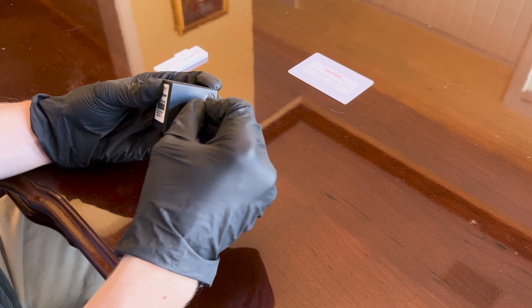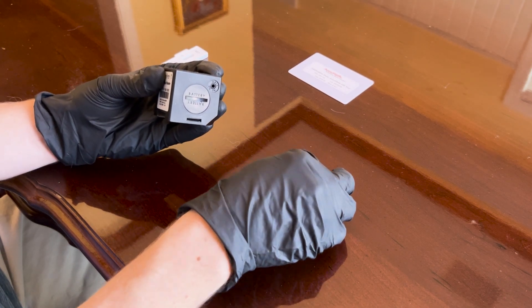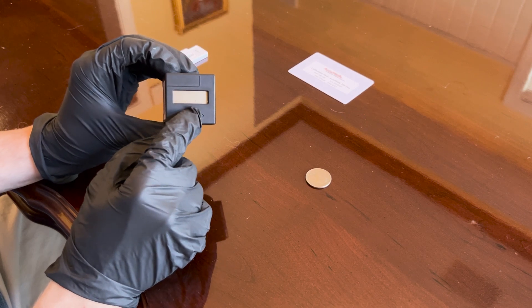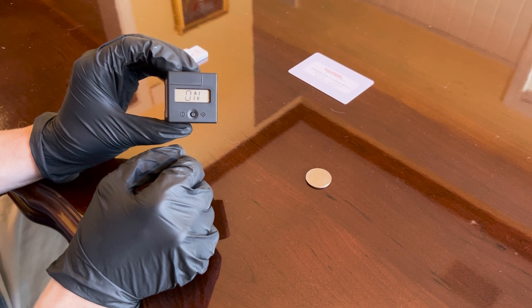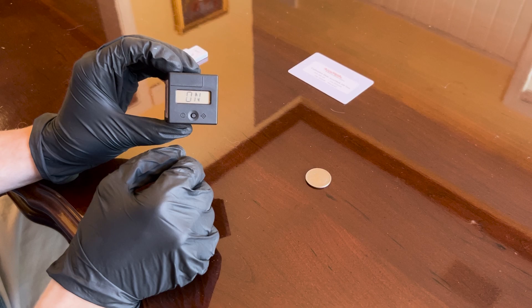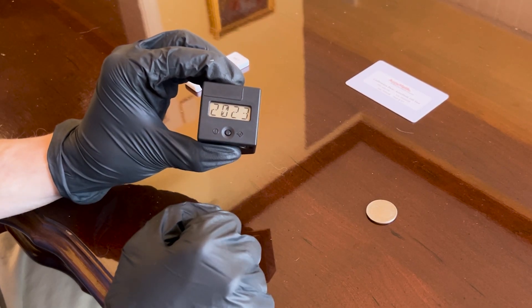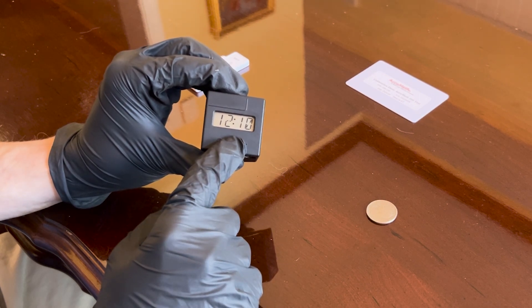To turn on the black box, press the button briefly and an audible alarm will sound, along with a visual display indicating that the box is on. Go ahead and set the date and time — press the button twice and the year, date, and time will start to cycle on the display.